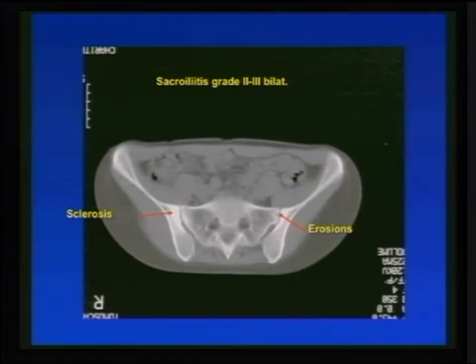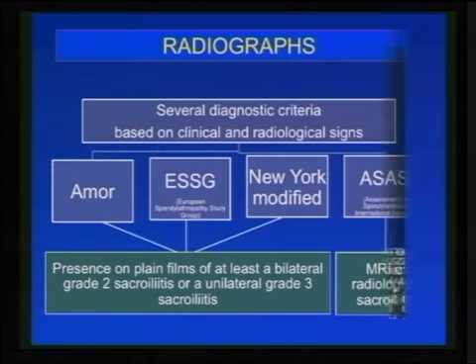The sacroiliitis in those patients, you might have presentation with any other clinicians presenting these cases for you. Is it really bilateral osteitis condensans ilii or not? If you see some sort of sclerosis to the other side, you see definite erosions, these are definitive for sacroiliitis.